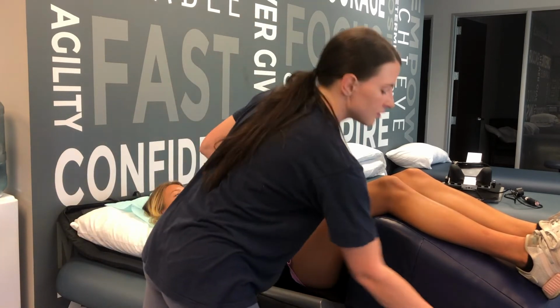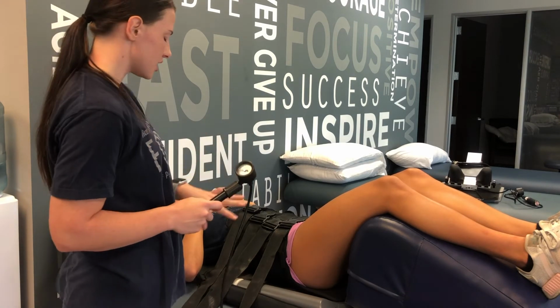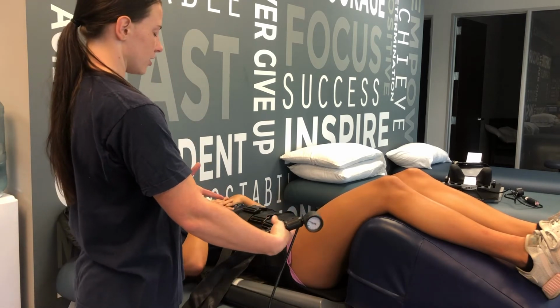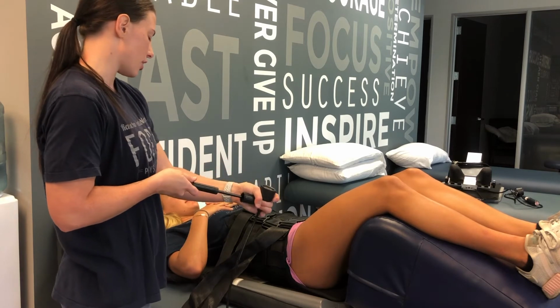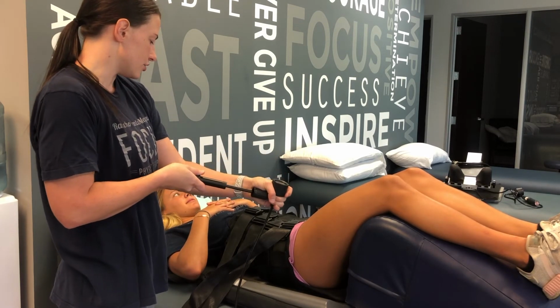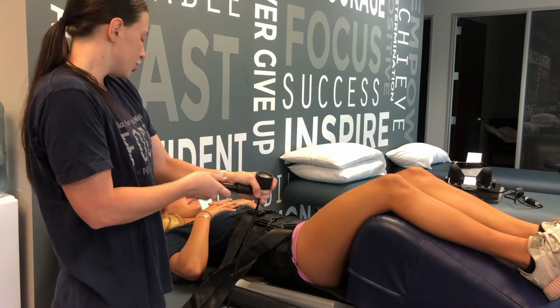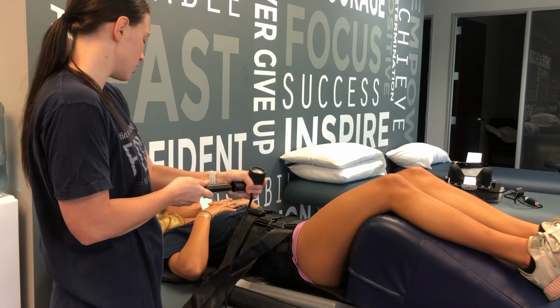All right, and then we're gonna move it to that middle section so that we can start moving the traction. It's gonna move this gray platform downward where it's pulling on their lumbar spine to kind of create some space in between her vertebrae. So we're gonna start that. This one, you don't usually have to go as slow as with the cervical one, just because it is a bigger part of the body. She should be feeling kind of her hips being pulled down a little bit.